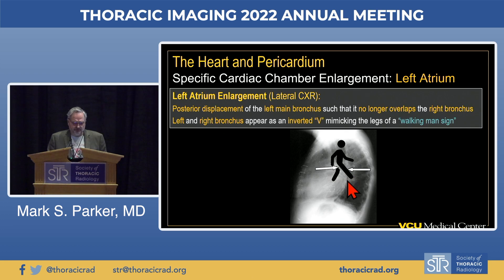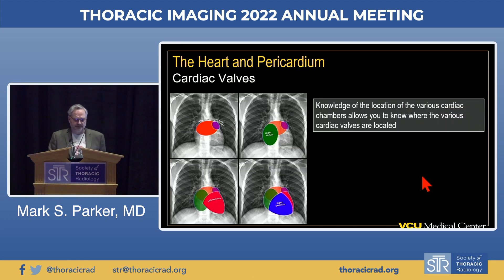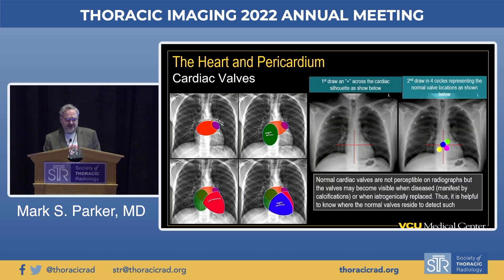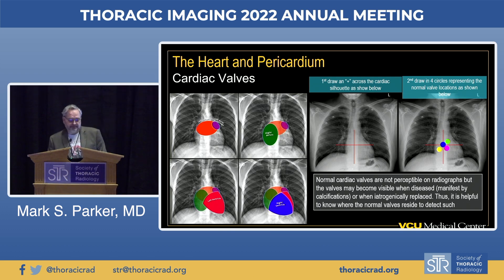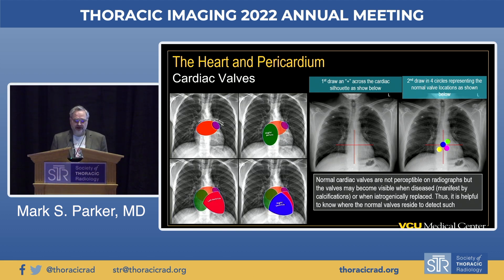Notice how the upper posterior border of the myocardium is enlarged from the left atrial disease on the lateral view. Knowledge of the location of the various cardiac chambers allows you to know where the cardiac valves are located. The normal cardiac valves are not visible on your radiograph, but may become visible when diseased—manifest by calcifications—or when iatrogenically replaced.